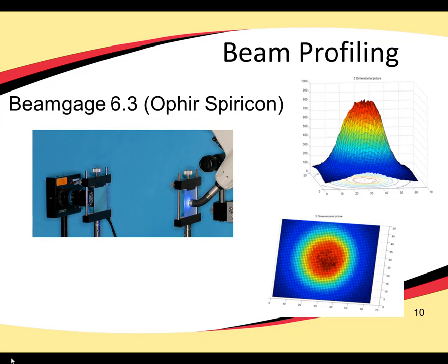We also looked at the beam profile for each light tip. The beam profile describes the irradiance value, radiant energy, over the surface of the light curing guide. The red areas of those beam profiles have the highest irradiance, which is good. The violet and blue areas have much lower values.